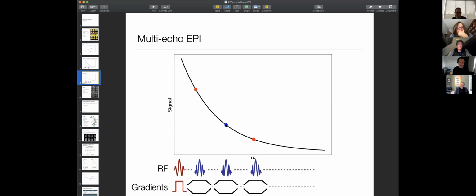Echo times that you start putting in after the optimal echo time of the sequence will extend the timing of your sequence. So be careful. It potentially seems tempting that you want 8 echoes, as many as you can collect, but things that come after this blue echo time will slowly start extending your sequence. From what I understand from Joe at CFMM, we do have the multi-band version of the multi-echo sequences, so extending your TR is not as detrimental when adding an extra late echo.